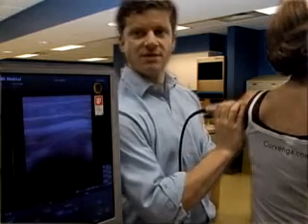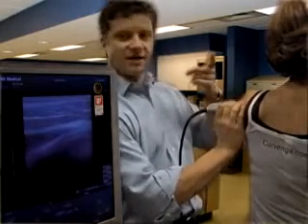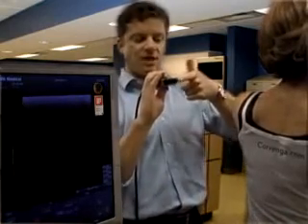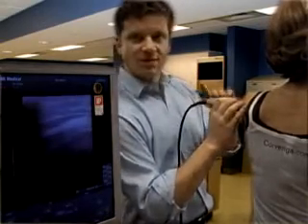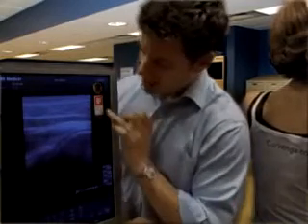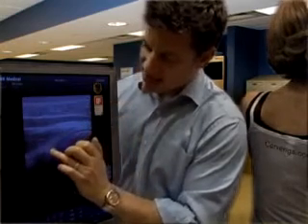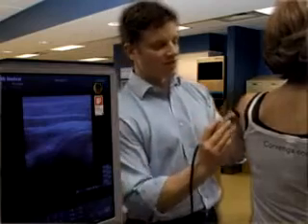Once we get back to the view — nice view there — we're going to take the needle and come in from the lateral side, lining it up in the long view so that we'll see the tip and the shaft of our needle, and pop it in from the lateral side. With this technique, the needle will literally come over the top of the humeral head, and you can go right into or next to the glenoid. It's a very nice straight technique for doing a glenohumeral joint injection.